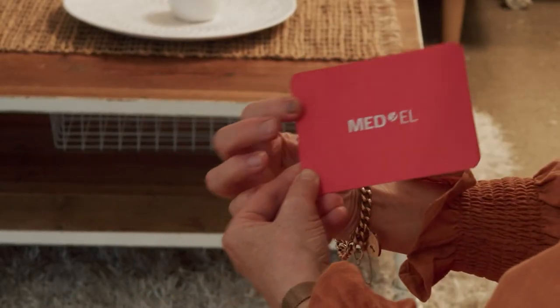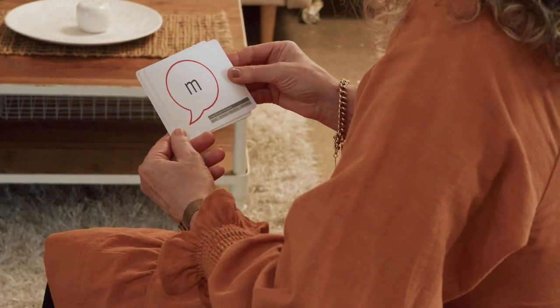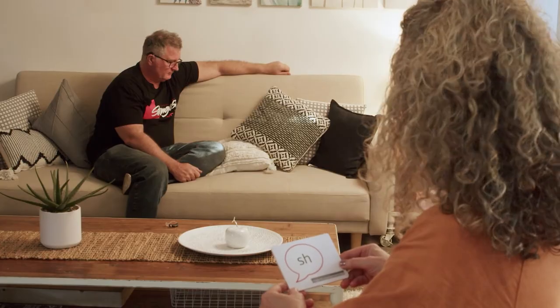Ready? The six Ling Sounds are then performed: Sh — Sh. M — M. Ah — Ah. E — E. S — S. Ooh — Ooh. Thanks, you got it. Thank you.